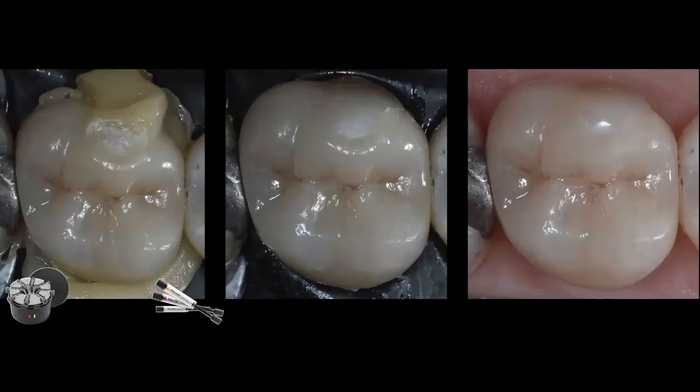But the most important thing is, and I forgot to mention this, you have to ask your lab technician to give you at least 200 microns of die spacer on your restorations. Because if you're going to use this warm composite, it is more viscous than regular dual cure resin cement. And that viscosity requires more space in order for you to fully seat this restoration, and have to do minimal minor adjustments on the occlusion afterwards. So please keep that in mind.